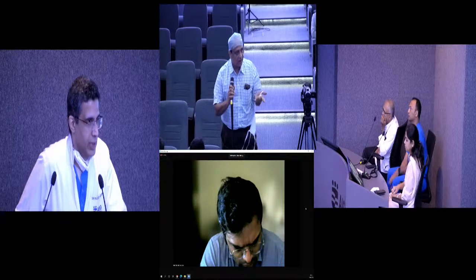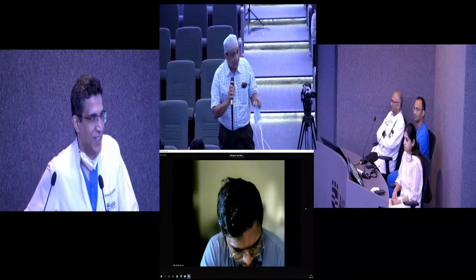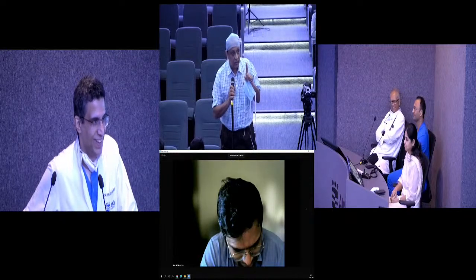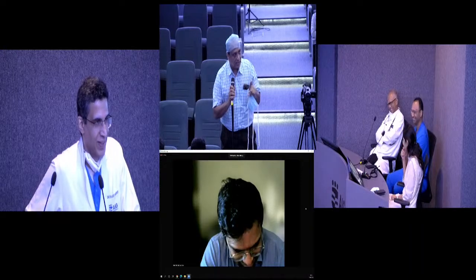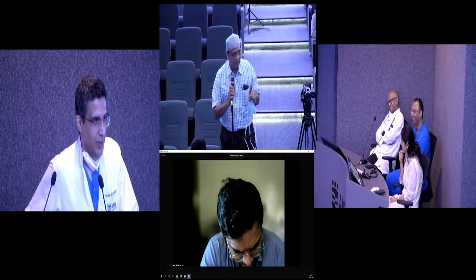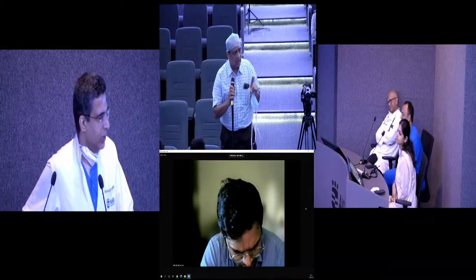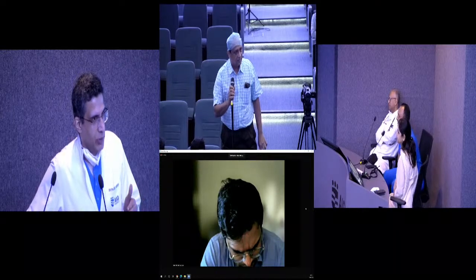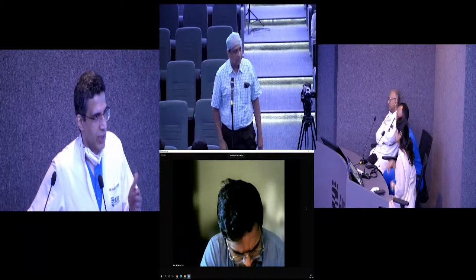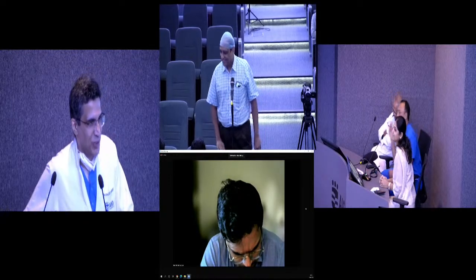But we should realize that CT surgeons have also gone away from the SWAN now. All are using only... No, not really. Except in specific situations, I don't think so. That's because of the cost constraint. If you go back to the United States, every patient undergoing CABG will have a SWAN, for sure, especially when you're doing beating heart surgery. It may not be cost, but I think the most recent studies have shown that people who use a SWAN for every surgery are considered slightly of the ancient age compared to people who use CVP.